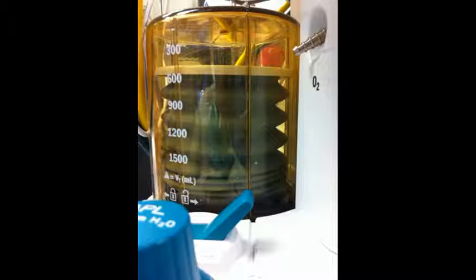This is to control the mode of ventilation. To the left allows spontaneous ventilation, and flicking the lever to the right allows the ventilator to be activated for controlled ventilation or automatic intermittent positive pressure ventilation of the lungs.